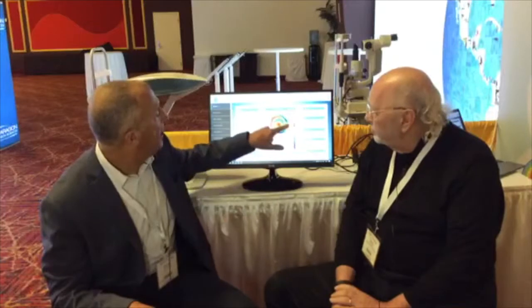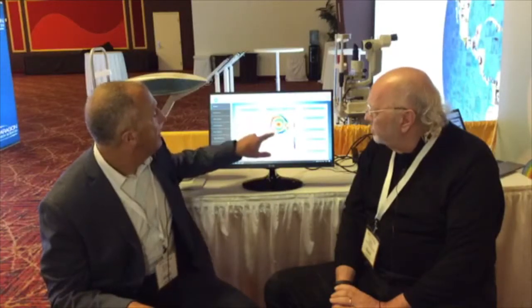Yep. But also now, as you see here, we're out in the sclera. And what the colors are, similar to what we all know with our topographers, are telling us the height and depth of that. These blue are sort of the lakes, those deep lakes, very steep, and these red parts flatter. And we then can gather all that information. It's going to give us more than we probably ever want to know. Right. But it's going to give us all the information that we need to fit accurately any large diameter lens. Sure. So the coloration shows us the different elevation areas of the surface.